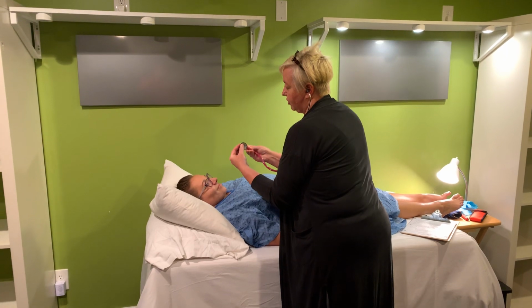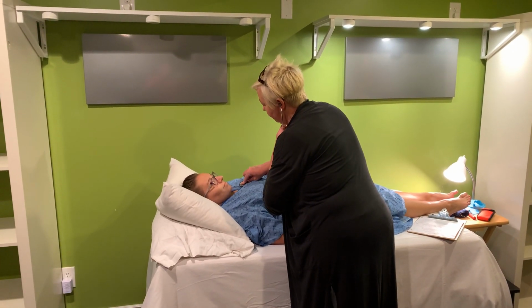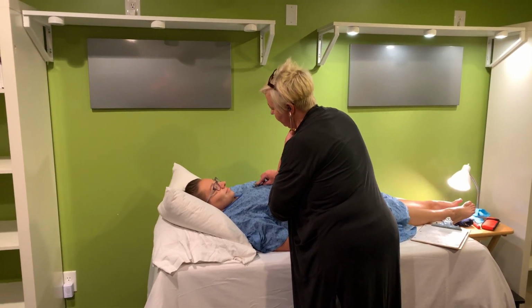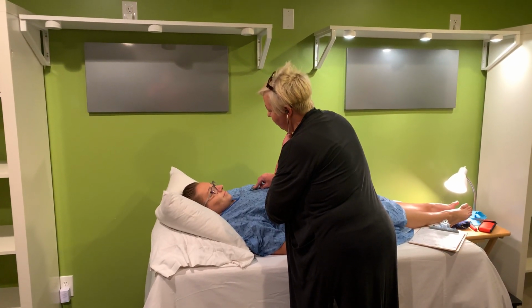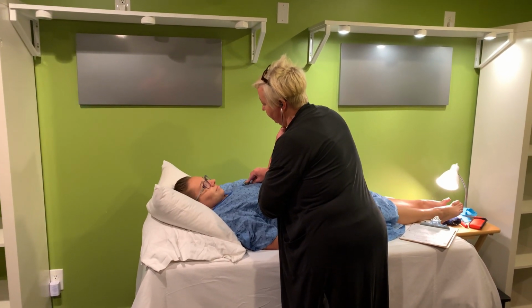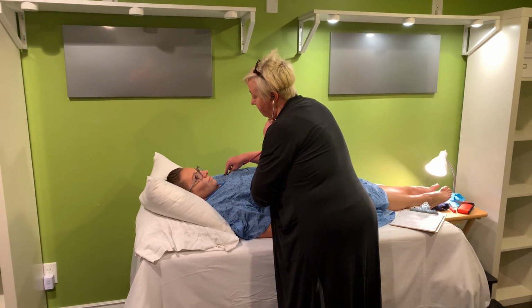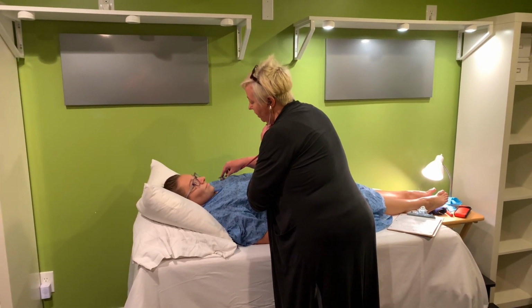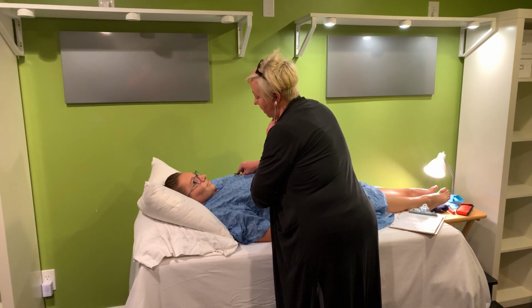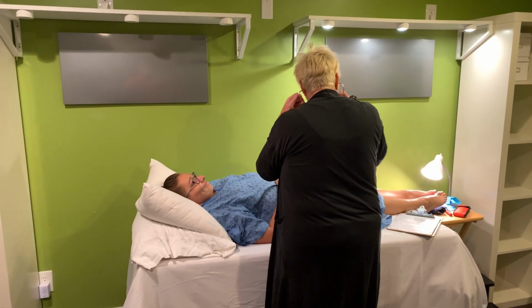Okay, and now I'm going to switch it, and I will use the bell side. When I'm listening to the S1 and the S2, they are part of the cardiac cycle. The S1 is the systolic portion, and the S2 is the diastolic portion of that cycle. Okay, Ashlyn, that sounds great.